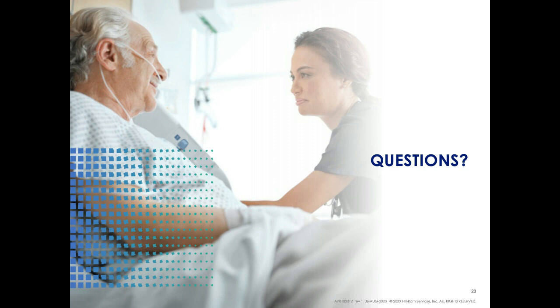I can take that, Natalie. I can start on that one. So probably a couple different meanings to the term remote, right? As we're thinking about respiratory monitoring of patients, when I see remote, I would put that in the context of, as an example, inside of the hospital, these technologies can be connected into a central station that we also offer to allow that remote monitoring capability of monitoring a patient in the room from a centralized view of those patients being monitored.